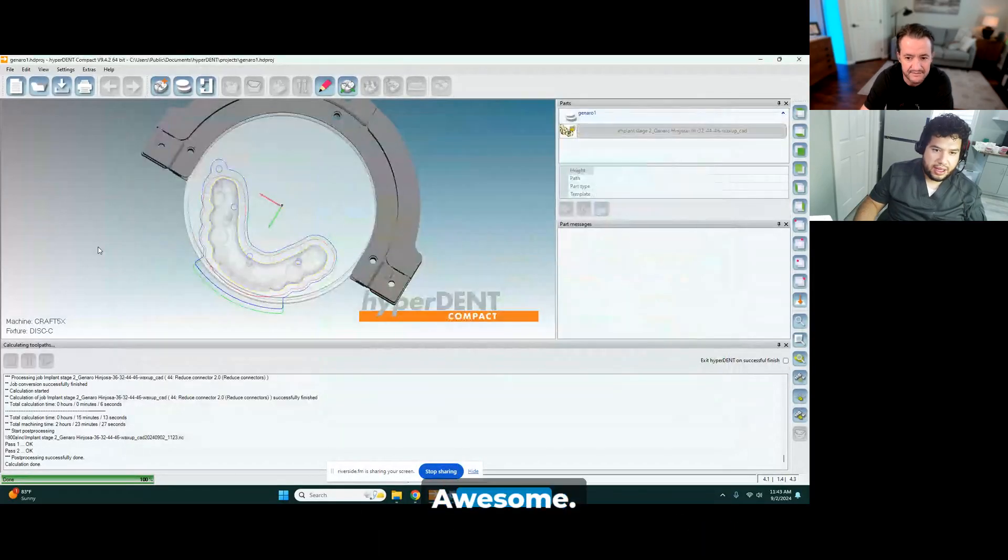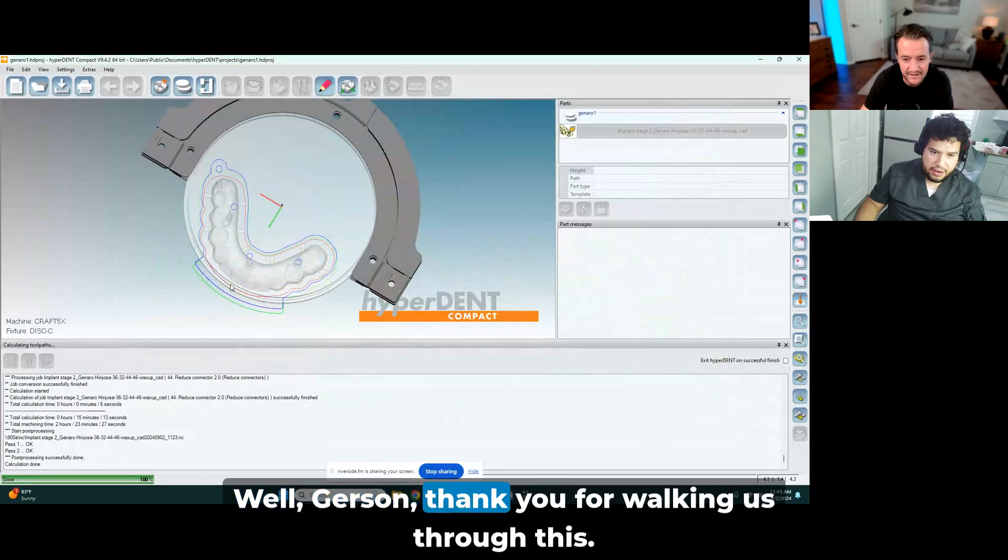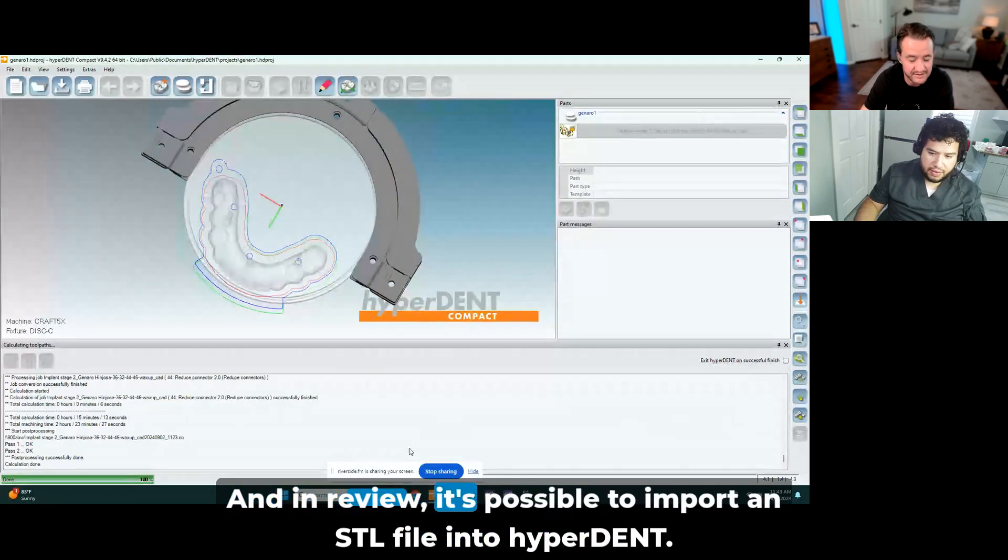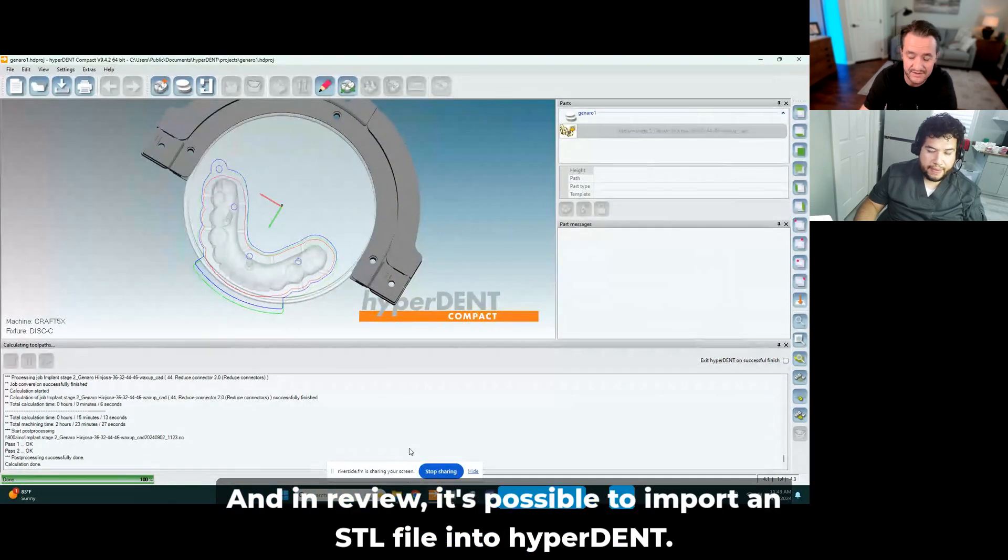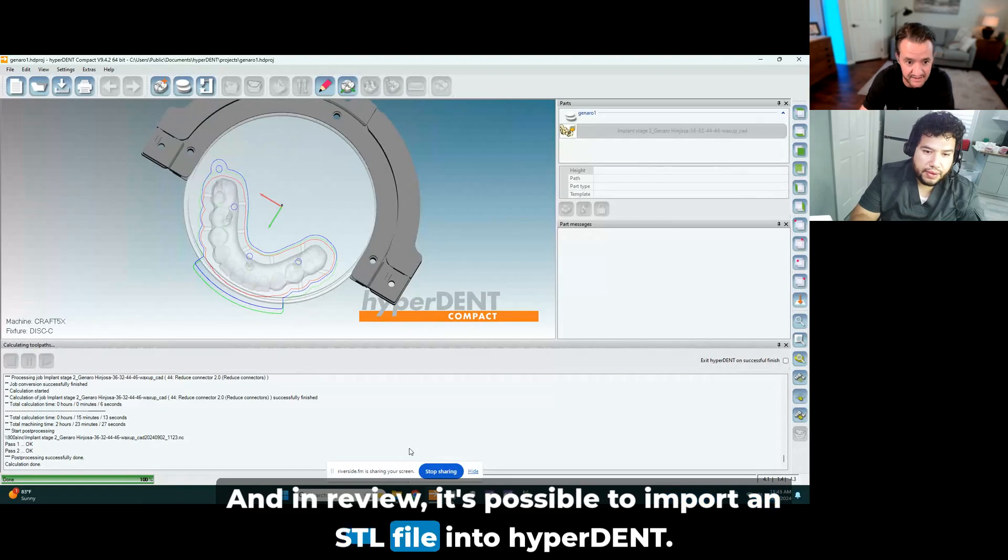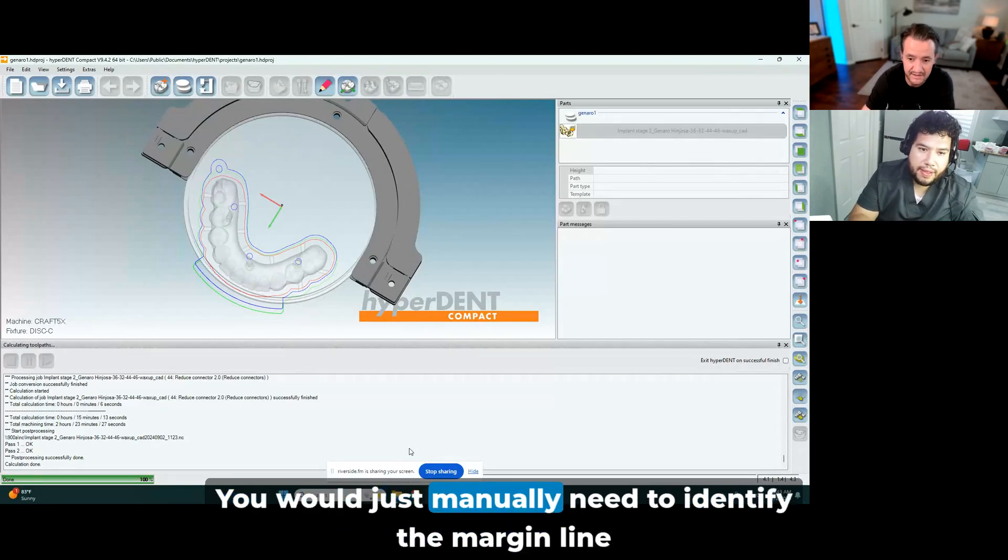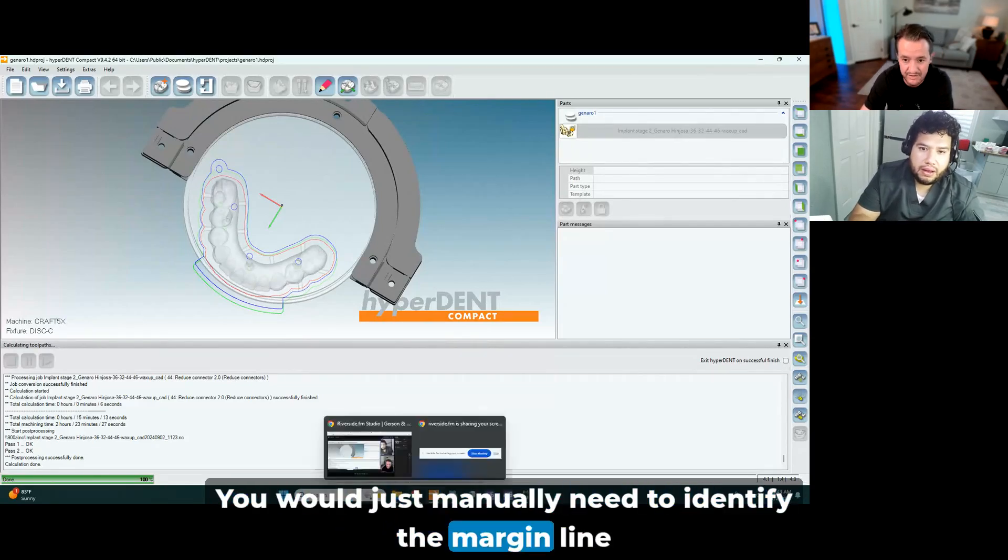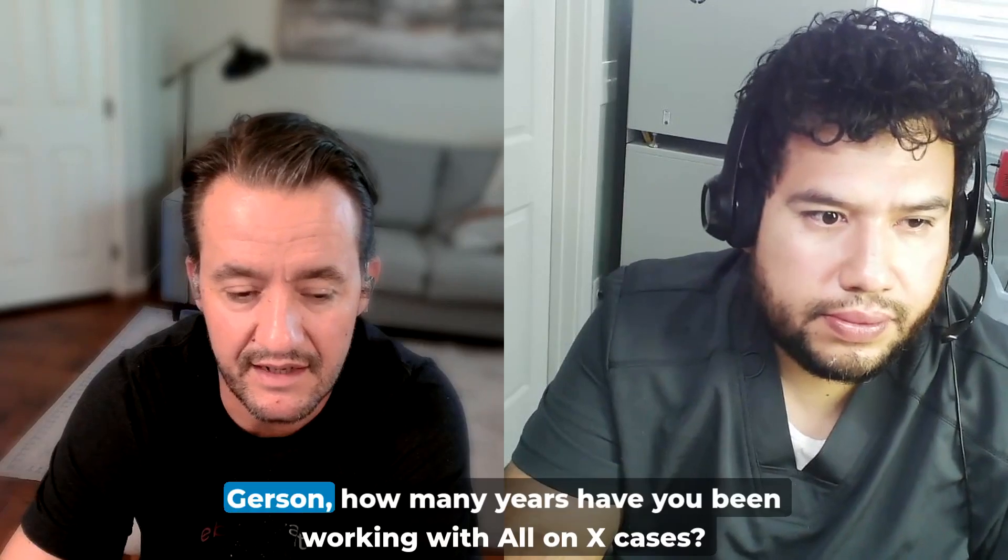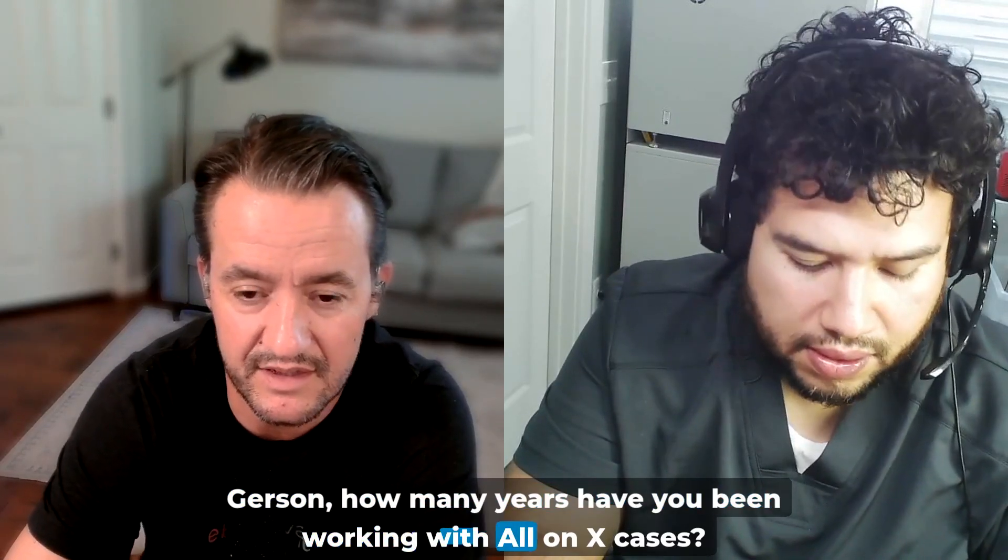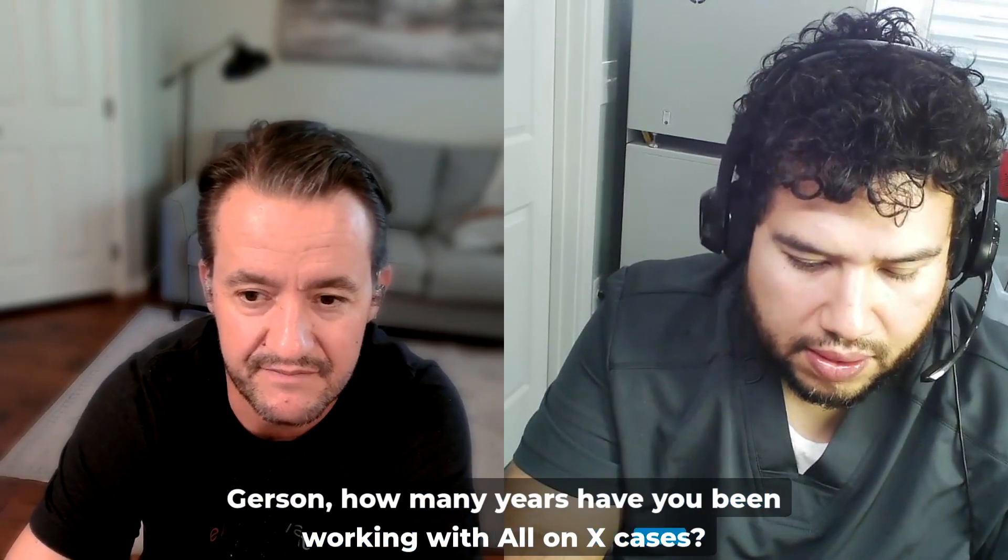Well Harrison, thank you for walking us through this. And in review, it's possible to import an STL file into HyperDent, you would just manually need to identify the margin line. Harrison, how many years have you been working with All-On-X cases? Almost eight years.